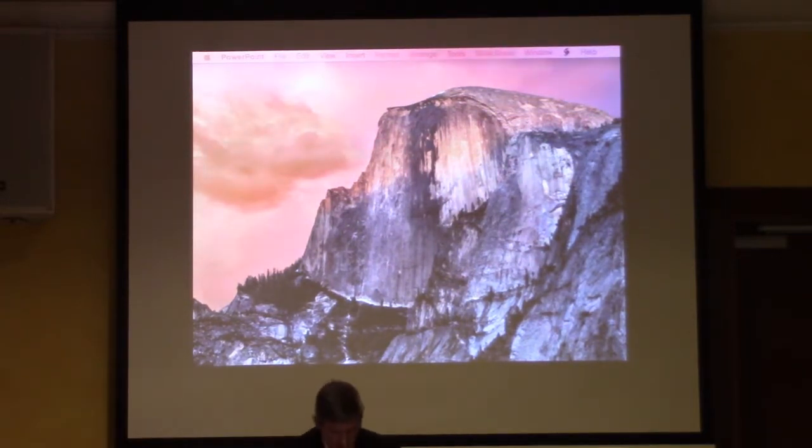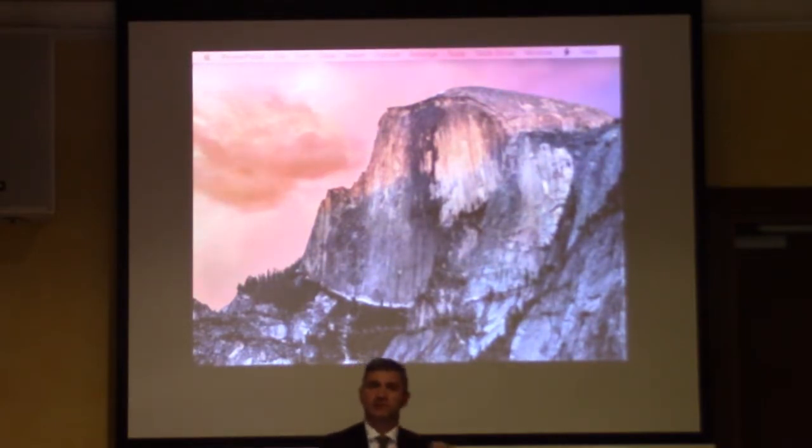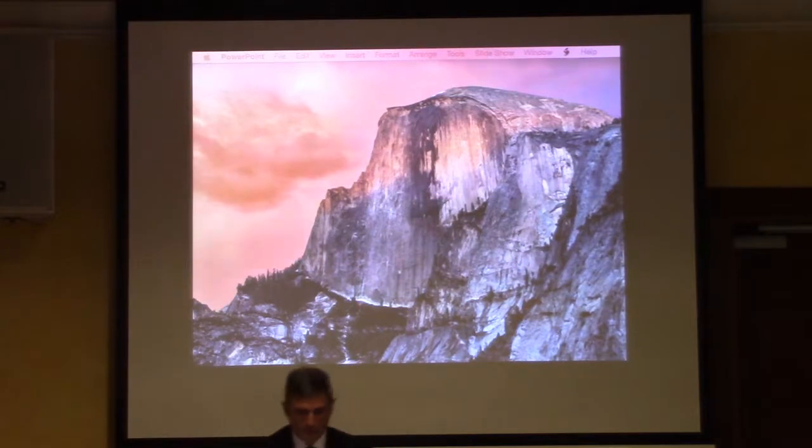No. So the reliable aspects that we're going to look for tumour response will be change in T2 signal. Usually it drops, unless the tumour response is to become mucinous, in which case it will go up. So change in morphology of the tumour, but enhancement doesn't add anything to it. So it slows the scan down and doesn't give you any useful information. So, okay. What we're going to do now is to go on to reporting.